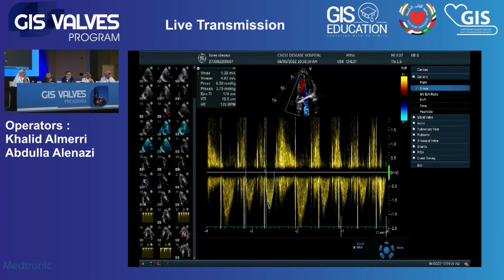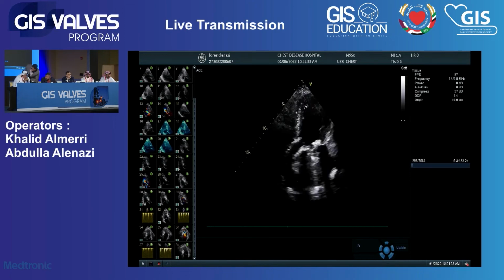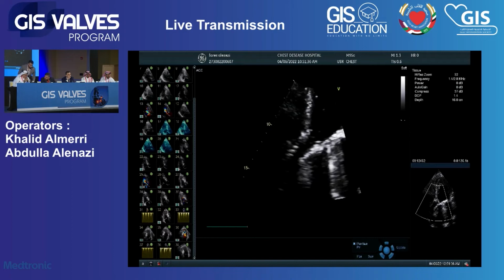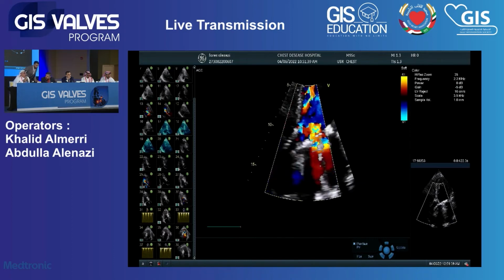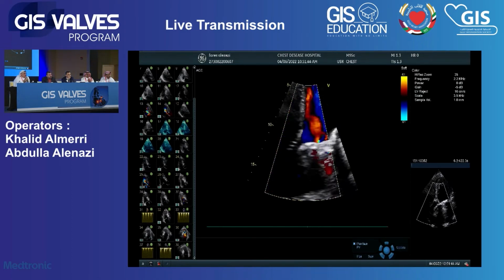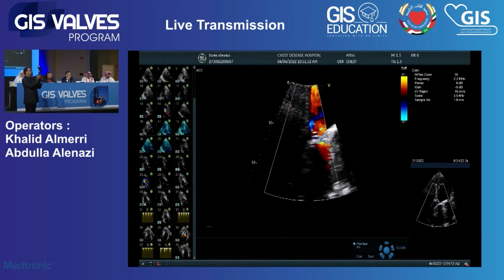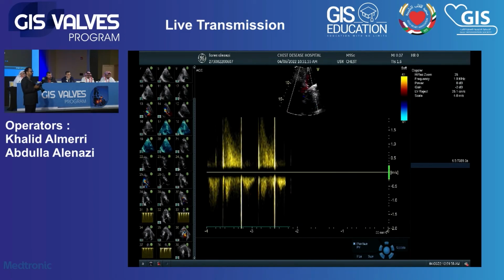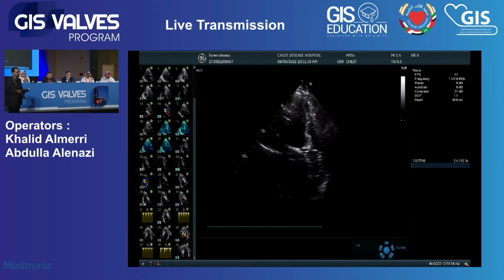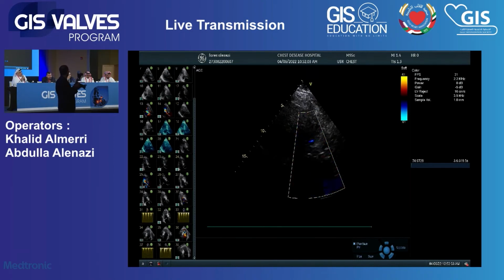Many studies have shown that the MRI findings post-TAVI are really frightening, but there is a clear discrepancy between the images and the clinical outcome. So the question is whether we should define high-risk patients in whom Sentinel or any protection device should be mandatory. But using it systematically, I think there are not yet the data to show it. Right. Thank you. It is exactly like for the coronary, where finally the protection system didn't show any significance in randomized trials.